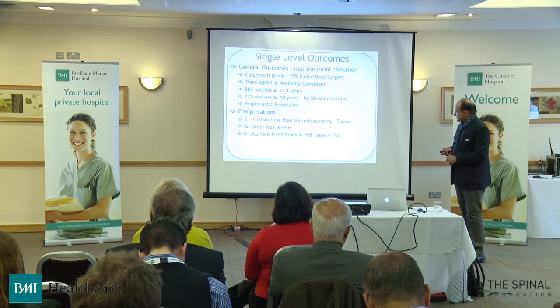And for instance, in the first 958 cases, which included my development curve, my learning curve, we had 8 recurrent protrusions. In a current audit, now of 4,350 foraminoplasties that I've done, and 3,500 plus laser discectomies, we've had 9 infections and 7 dural tears. Very sadly, we had 2 last Christmas, but which ruined the figures.